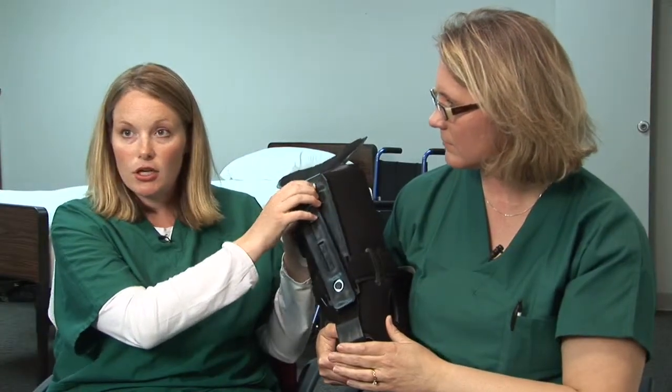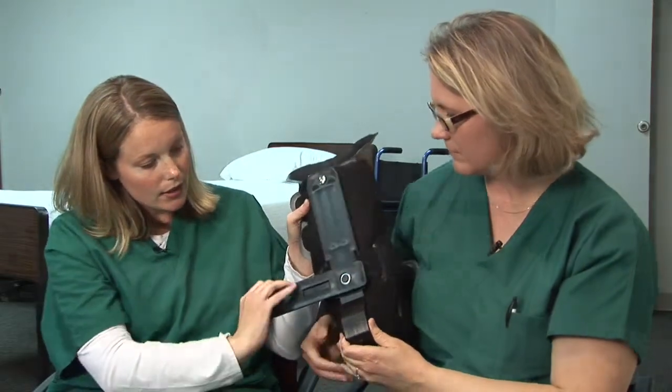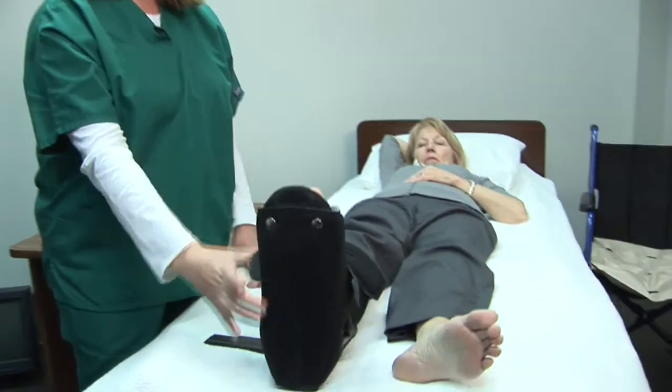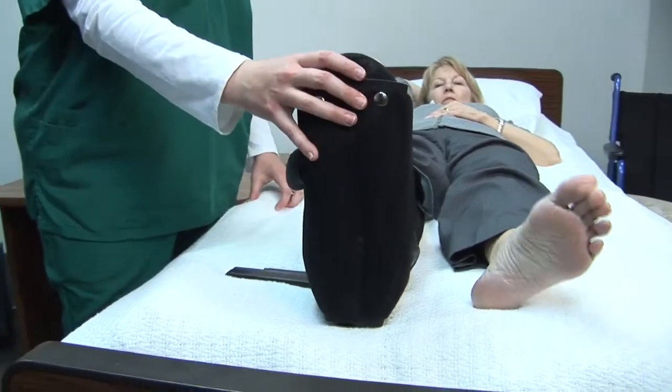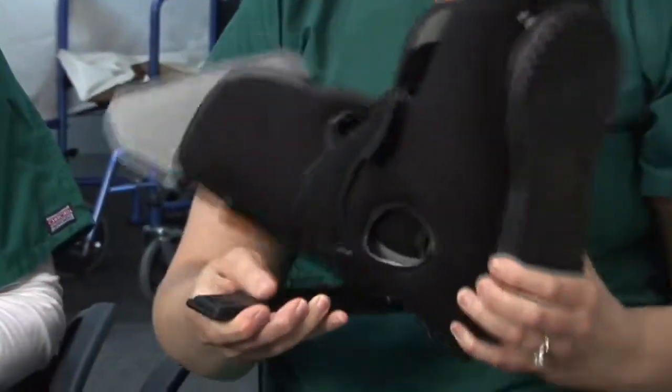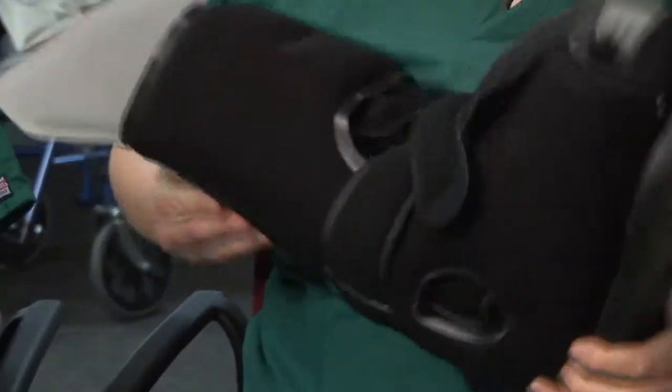On the back of the boot is this anti-rotation bar. And basically, what this does is, if a patient's lying in bed, this keeps their hip from rotating inward or outward. And this is important because if you're in bed for a long period of time, your muscles on the inside or outside of your hips can get weak. And so we really need to keep that hip in neutral alignment, or what's optimal for that person, so that when they get stronger and they can get up and walk, they won't have any abnormalities.